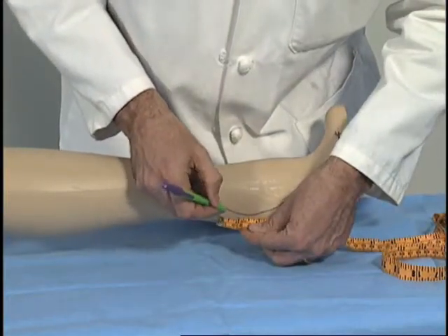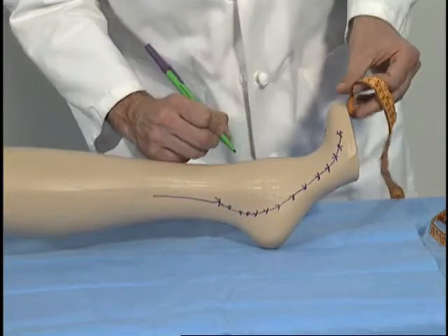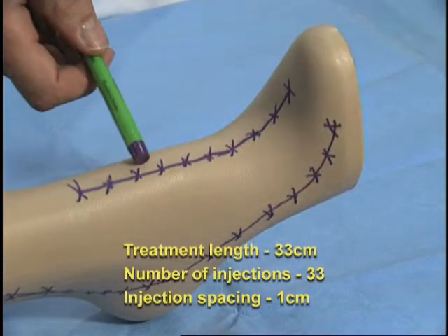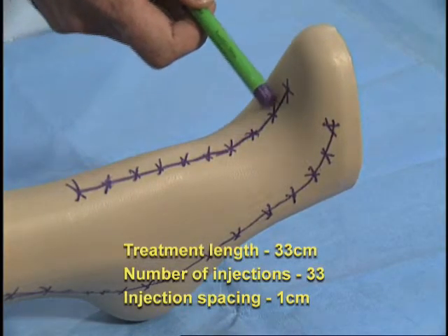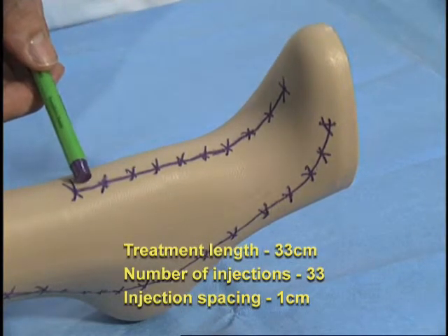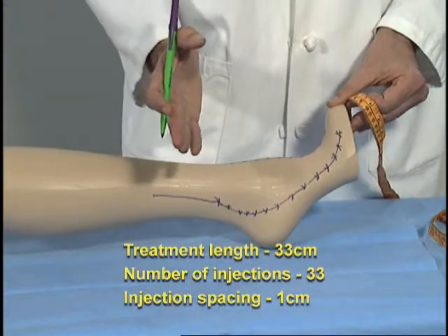So 1 cm intervals, and the same anteriorly. The injections along the dorsalis pedis cover 10 centimeters in length. We've spaced them at 1 centimeter intervals. 33 injections. That leaves us with 7.